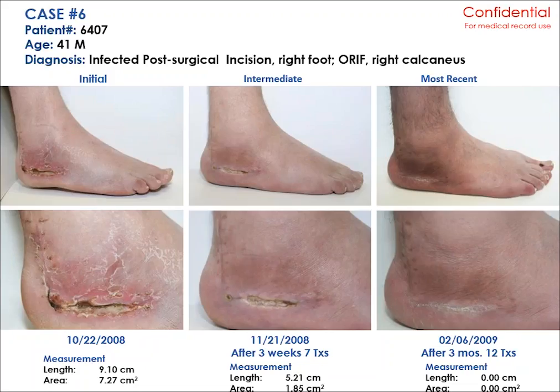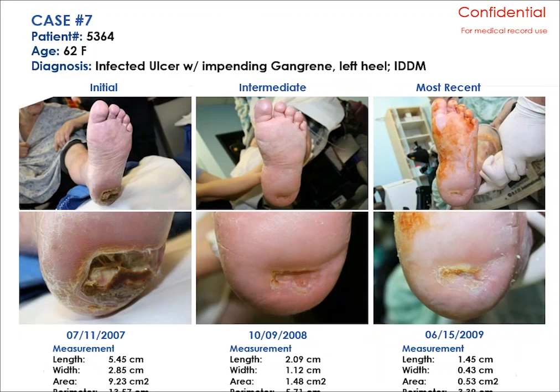These, again, an example of a post-surgical infection complication as a result of calcaneal fracture, and then the surgery, osteosynthesis with quite a few screws and plates in the calcaneal region. And again, there was a risk of developing osteomyelitis. If you take a look at the picture on your left, at the very bottom of this lesion, you might see even the surface of that titanium plate. So over the course of 3 months, we're able to heal completely this non-healing lesion and resolve the situation with infection.